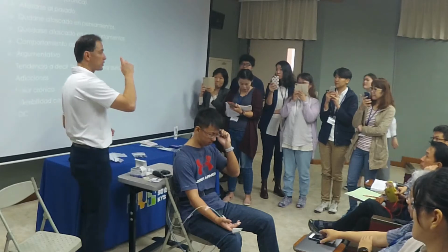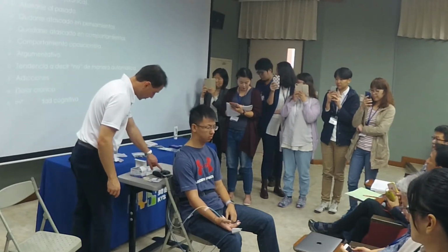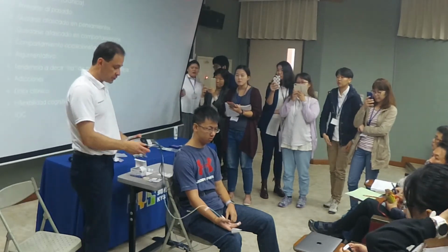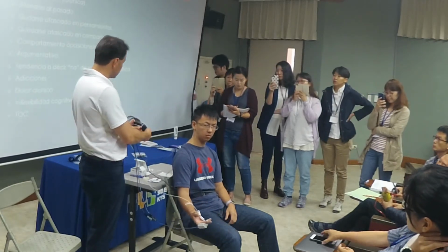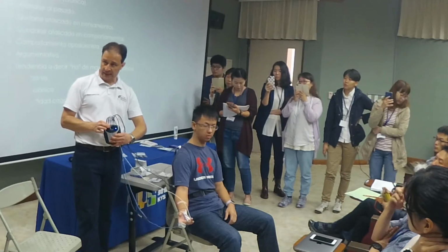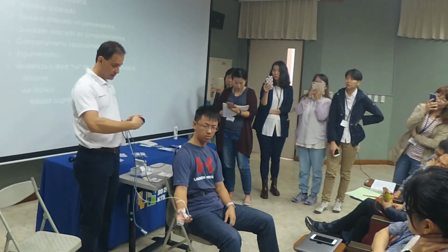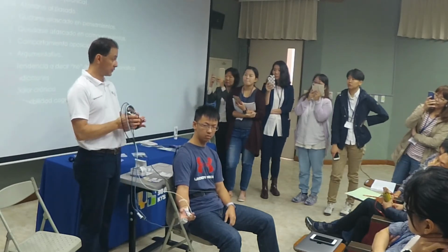Now I need the USB port for the Nexus amplifier, please, because I need to sync it up with the computer. So what you do is you turn on the amplifier from this on button, and it starts there. It shows you the charge remaining in your battery, your date. And the Bluetooth is blinking, so I need to sync it up with the computer.